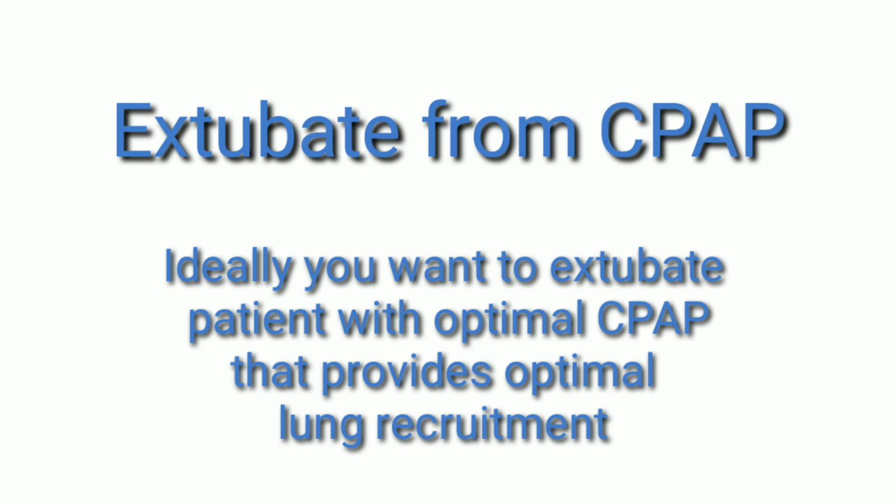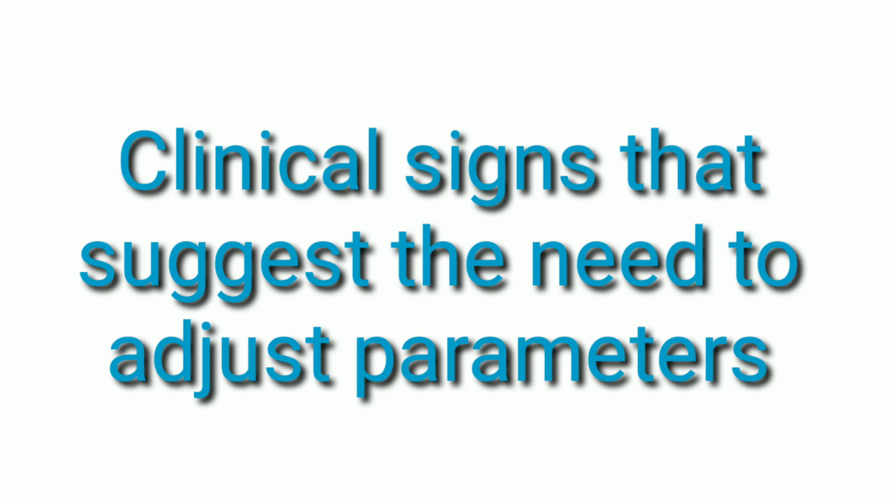I do suggest, if you're going to drop the PEEP and really challenge them on the 0, to recruit before extubation, as well as looking at the patient's work of breathing. If you see the patient on expirations almost trying to force out the expiration, you see this typically in somebody who's obstructed, who's having an asthma or COPD exacerbation. They've got that air trapping, and they're trying to push out that air to correct the FRC.